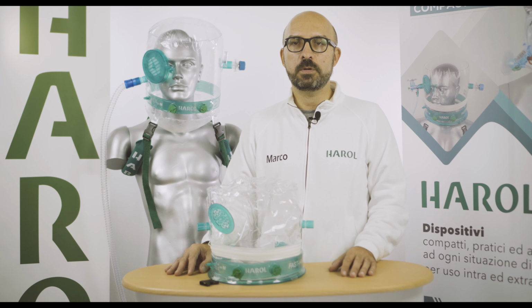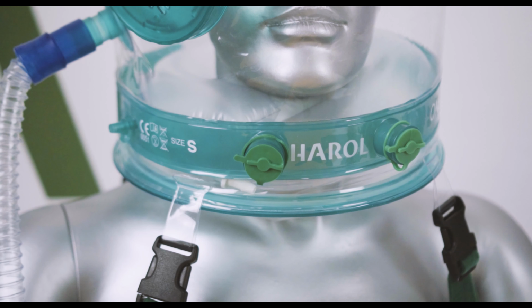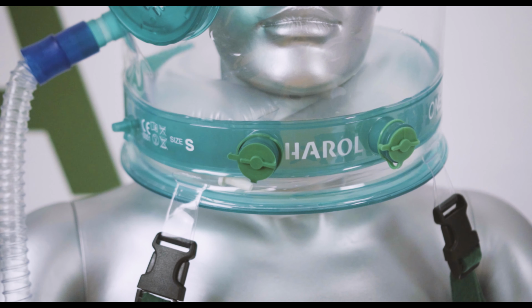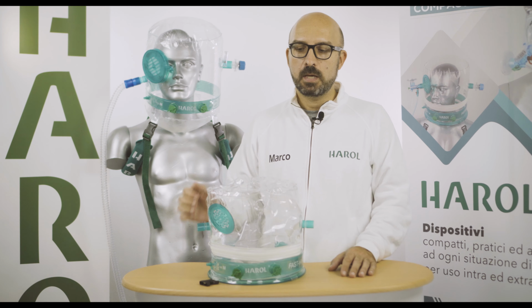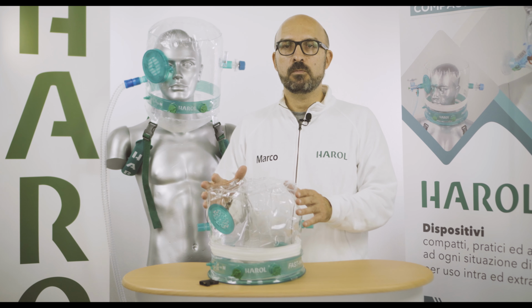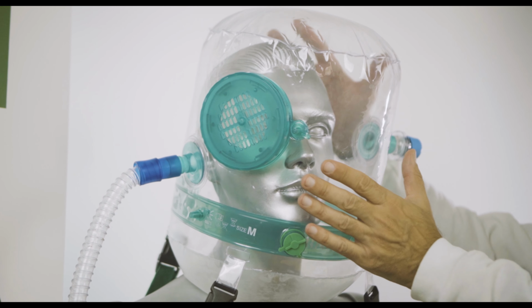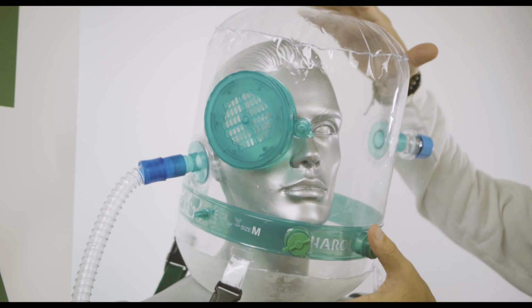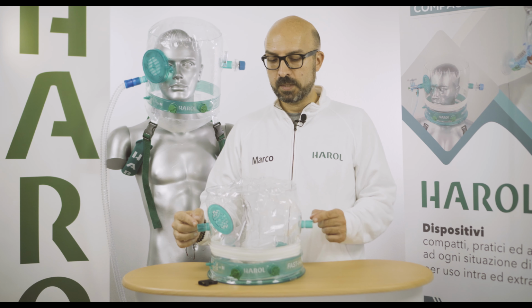In this video, we see how to choose the right helmet for proper therapy. First of all, we must choose the helmet for CPAP therapy or for NIV therapy. The NIV helmet has a smaller volume, 11 liters against the 15 liters of the CPAP helmet. The NIV helmet has two identical connectors, inlet and outlet, 22mm male according to standard ISO.